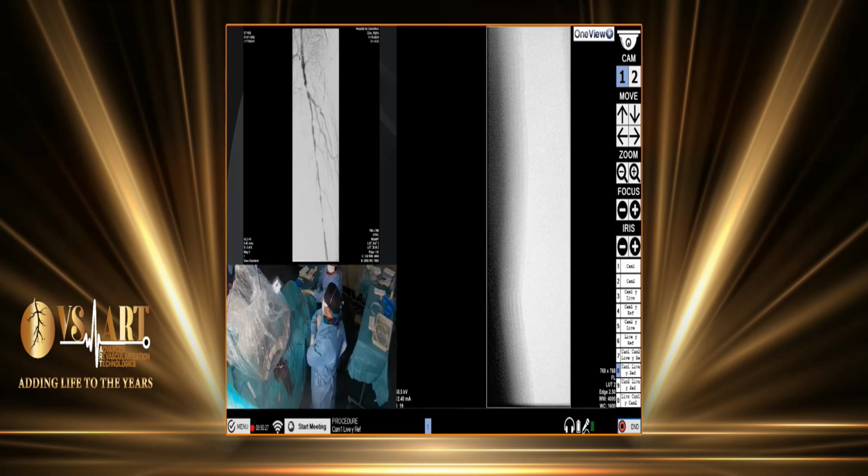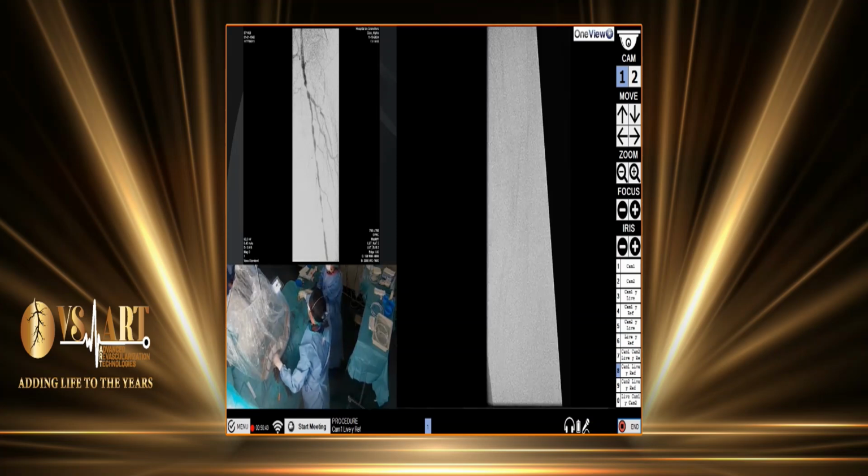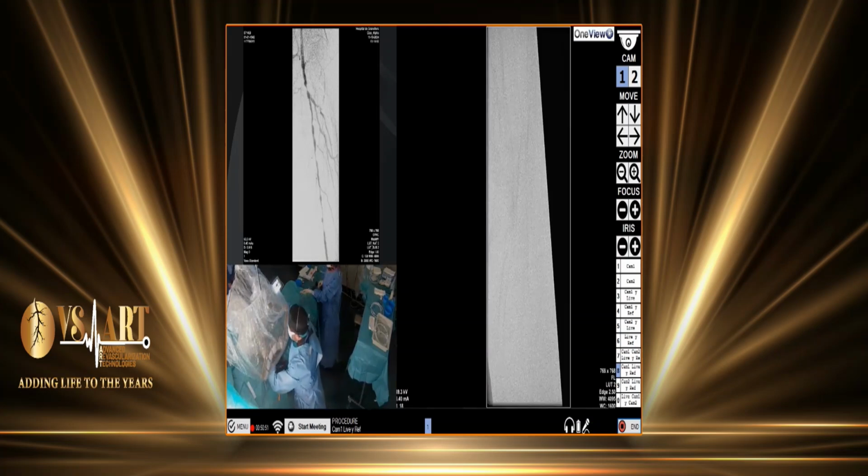and we consider it. But I fully agree that nowadays it's still the endarterectomy device. But the shockwave device maybe is a real game changer, even in this area. Do you use the shockwave device in this area? Is anybody using shockwave in the distal femoral, common femoral?